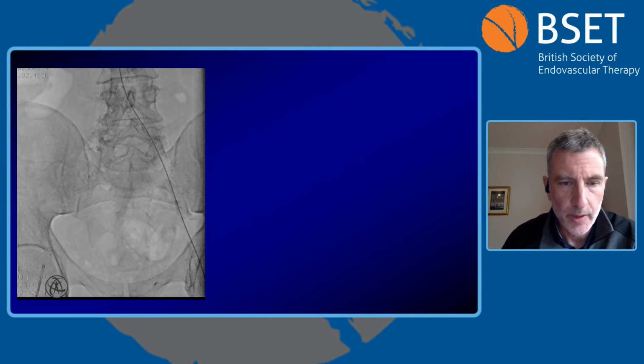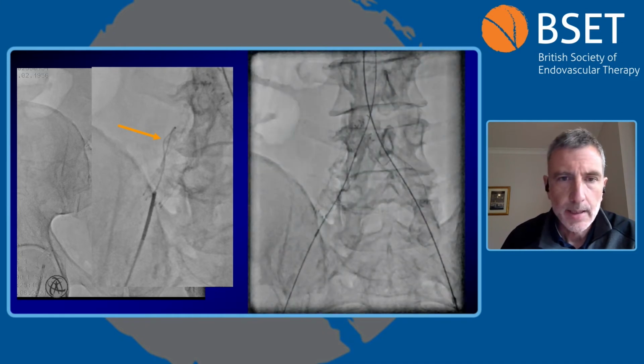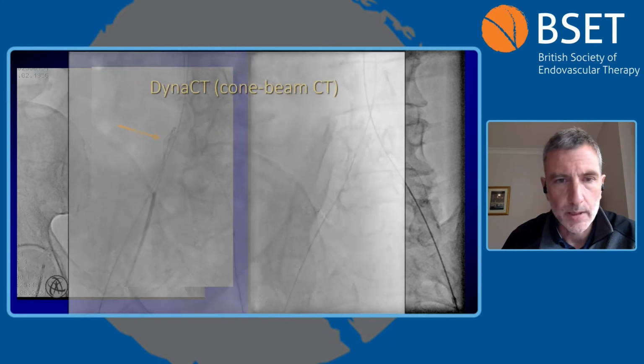So, percutaneous retrograde access on the left side, a guide wire up into the aorta. And as I said, prior to performing the endarterectomy and patch, we recanalized the right iliac occlusion. That was tricky with the guide wire recurrently going extraluminal to the occluded stent. Even after an apparent transluminal guide wire, we had a great deal of difficulty tracking a sheath up through the occluded stent.